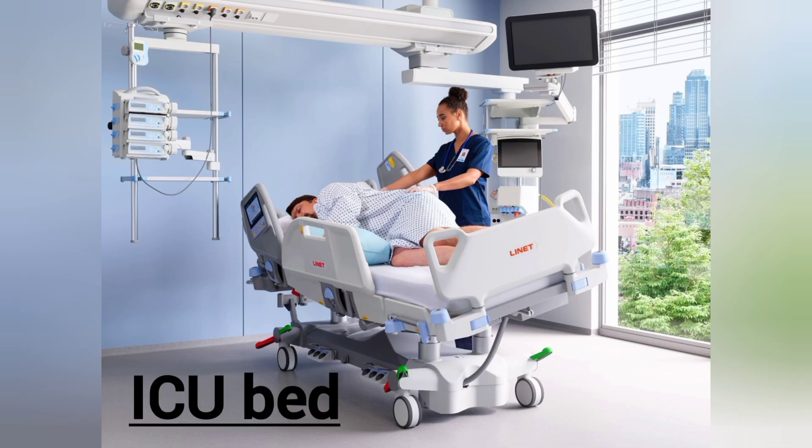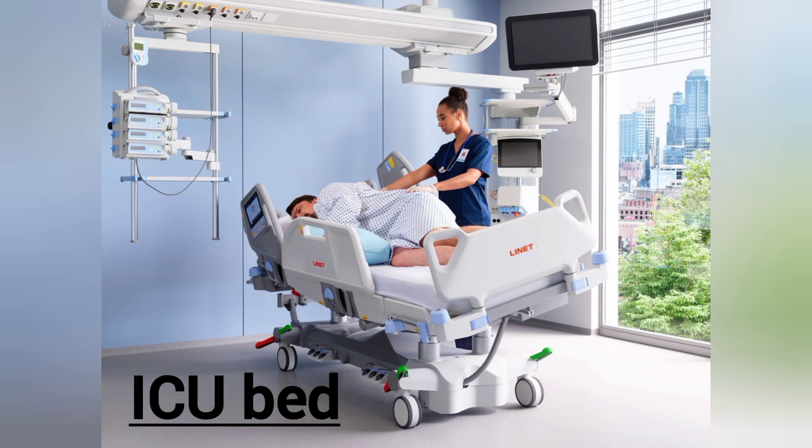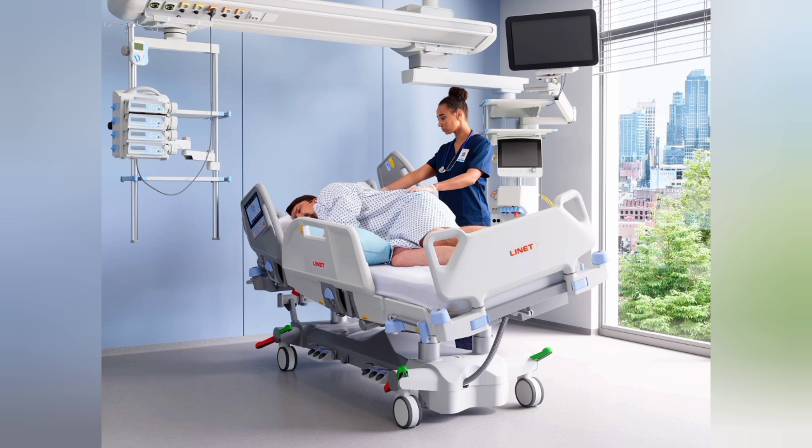The ninth equipment is the ICU bed. ICU patients are generally dependent on staff, nurses, doctors, or helpers. For different treatments in ICU, most of the time a patient needs precise positioning. For comfort, ICU patients need a specialized ICU bed.